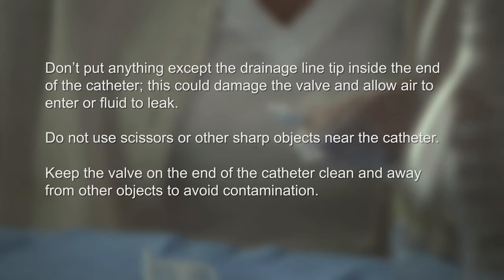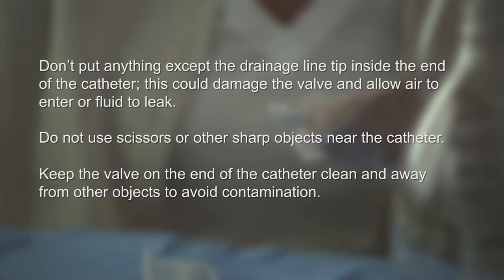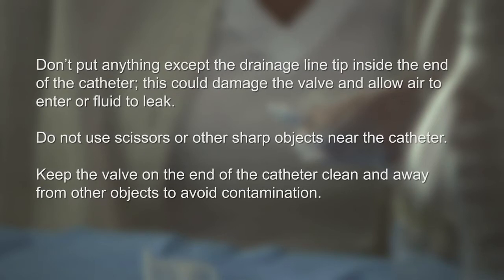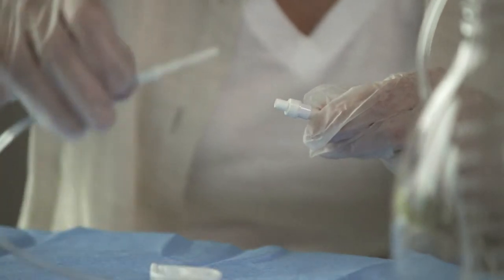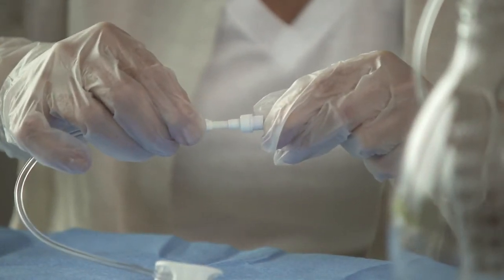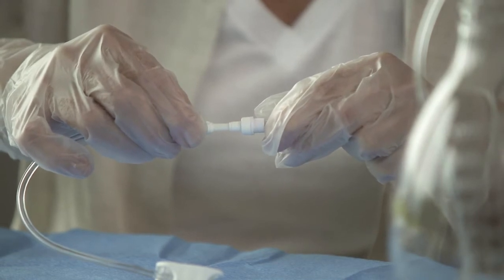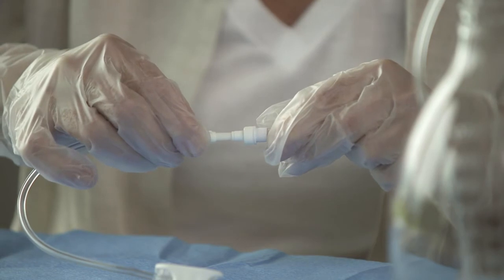And always remember to keep the valve on the end of the catheter clean and away from other objects to avoid contamination. While holding the catheter, pick up the drainage line near the access tip and gently insert the tip into the end of the catheter. You may feel and hear a small click when they securely connect.